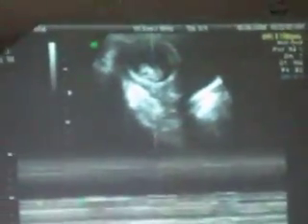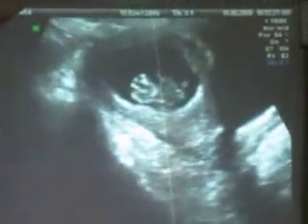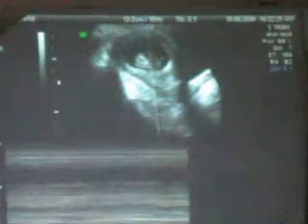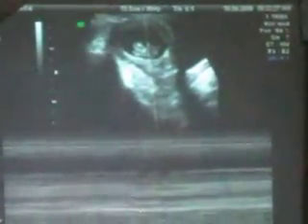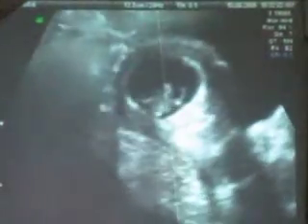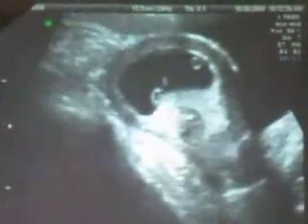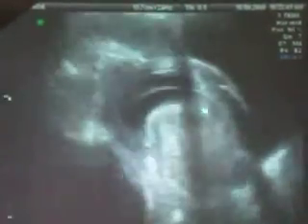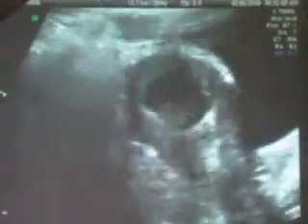Hello sir, we are here. We have got a patient who's 8 to 9 weeks according to the gestational age. And here I have got Arun scanning for you. You can see the heart rate which is racing now. So we've taken the heart rate. Now what I want you to do is, this is the trans-abdominal scan. You can see a little bit of the placenta developing here on this side. Let's do the crown rump length.